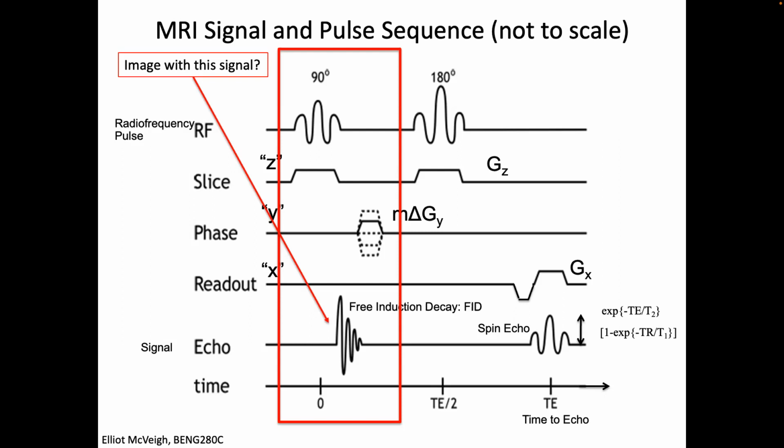And so anyway, they go, okay, let's do it. They hit go, beep, and because my back and my buttocks were right up against the gradient coil, it stimulated a ridiculous response in peripheral nerves and muscle contraction. So I just shot off the wall of that thing, like a fish in a boat. I just couldn't sit still. It's like, oh my God, that was incredible. From that time on, that scanner was called the Stimulator. And it was a great scanner.